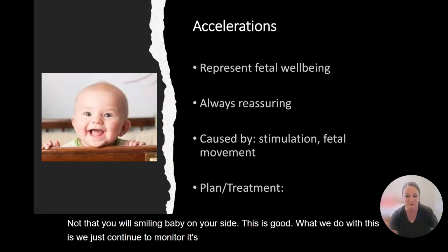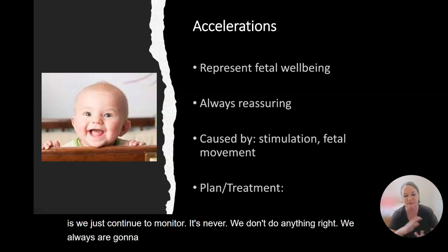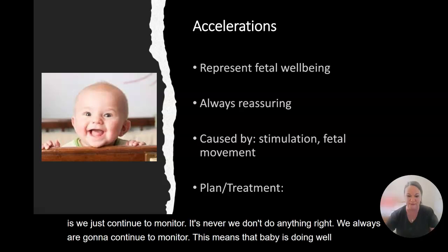We don't do anything, right? We always are going to continue to monitor. This means that baby is doing well at this point.